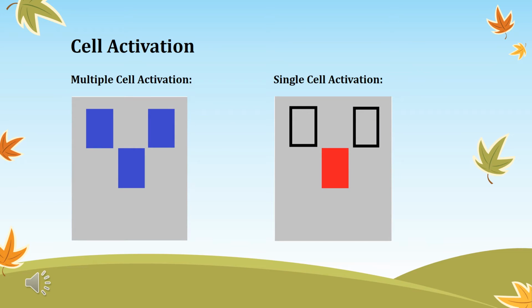When more than one cell is activated, the cell receiving the most radiation contributes the most electrical signal. Therefore, it has the most influence on overall exposure. For example, when all 3 cells are activated and an abdomen is positioned with barium over one cell and normal tissue over the other 2 cells, the final image will be slightly overexposed because the operational amplifier was dividing the incoming voltage by all 3 cells, but only 2 were contributing to the signal.